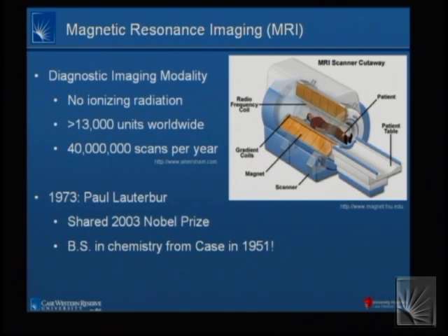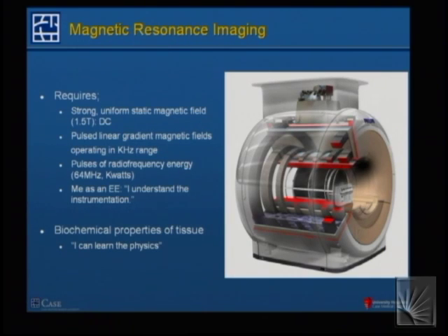So MRI is really a story of coils, okay? Different kinds of coils that I'm going to talk about today. We're going to talk about coils of wire that have current in them to create the main magnetic field that we're going to talk about shortly. We're going to talk about gradient coils to change that magnetic field in a linear way in a temporally dependent manner so that I can turn on a variation from head to foot, from left to right in the strength of the magnetic field. There's going to be other coils I use to transmit radio frequency and coils that I use to receive that radio frequency back. And we're going to go through some of the different technical specifications and characteristics of each of these different kinds of coils. So let's talk about the first one. That is, in magnetic resonance imaging, we need a really strong magnet.